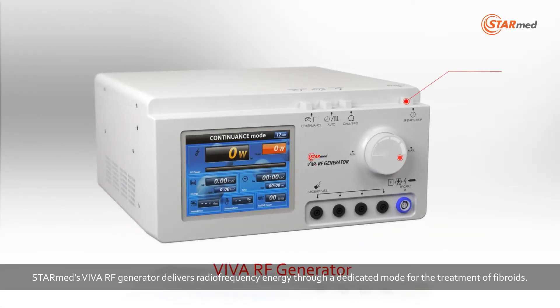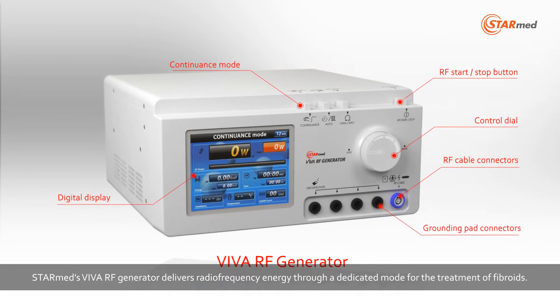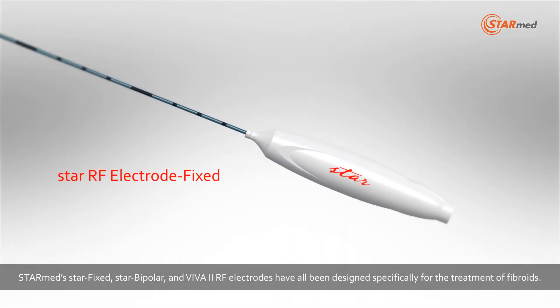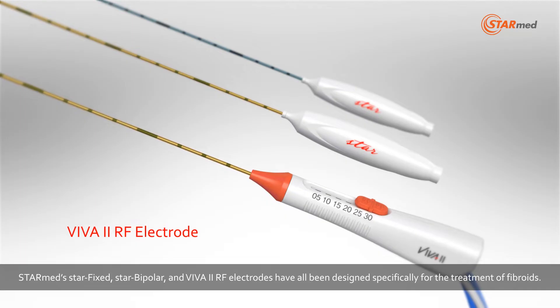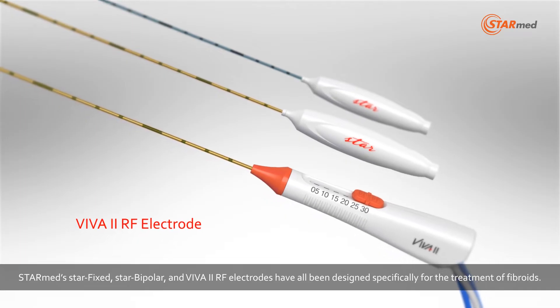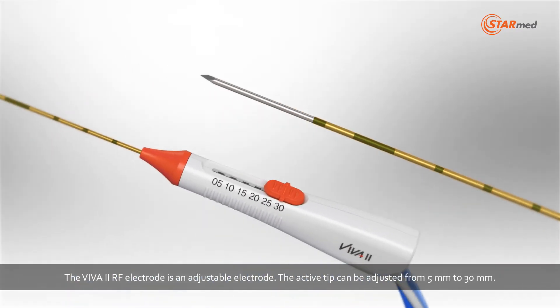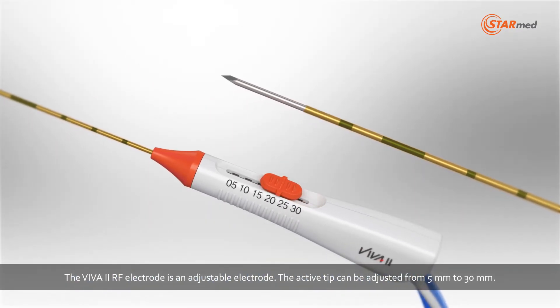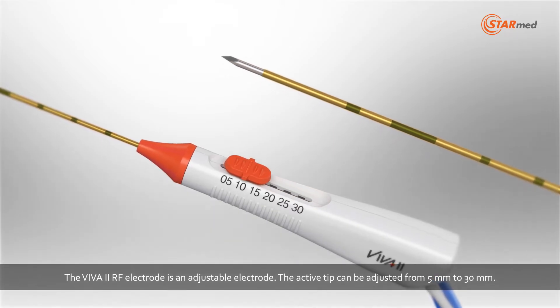StarMed's Viva RF generator delivers radio frequency energy through a dedicated mode for the treatment of fibroids. StarMed's StarFixed, StarBipolar and Viva 2 RF electrodes have all been designed specifically for the treatment of fibroids. The Viva 2 RF electrode is an adjustable electrode, and the active tip can be adjusted from 5 mm to 30 mm.